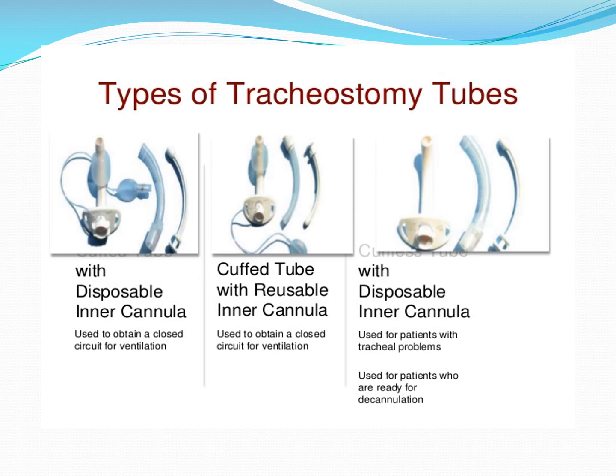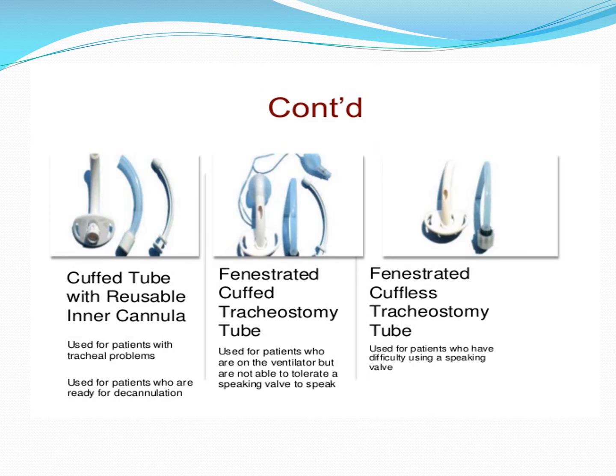Looking further at images, the left-hand image there is a tube with a disposable inner cannula. The middle one is showing you a cuffed tube with a reusable inner cannula, and then all the way on the right, one with a disposable inner cannula. And again, just giving you a little bit of the variations that are out there. This further demonstrates some of the options.